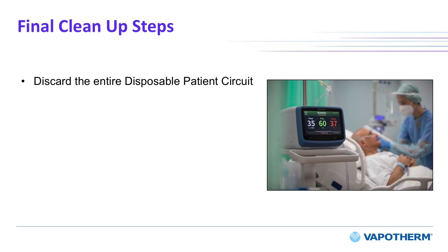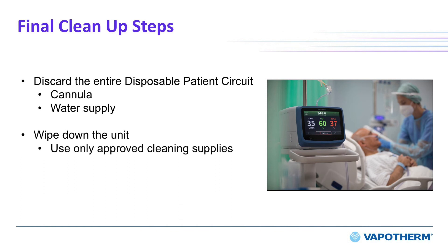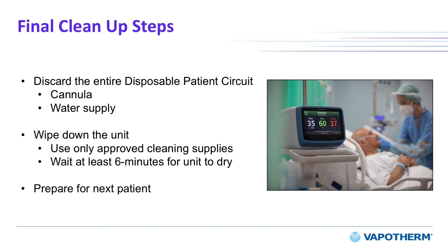Discard the entire disposable patient circuit, including from the cannula to the sterile water bag — yes, this includes the water supply. Using a super-sani cloth or other approved cleaner, wipe down the internal docking station and the HVT 2.0 unit. Wait at least 6 minutes for the surface to dry. Refer to the instructions for use for the full list of approved cleaners. Once you have cleaned the device, you are ready for your next patient.